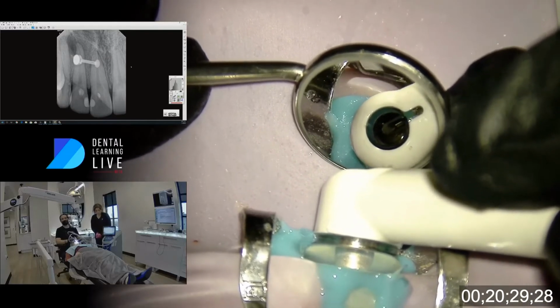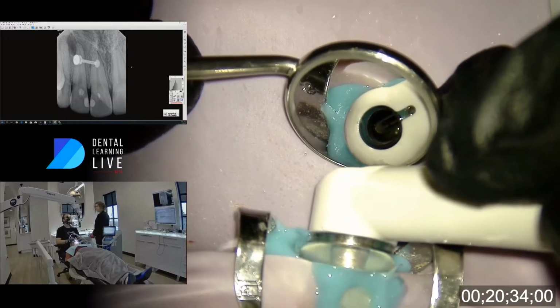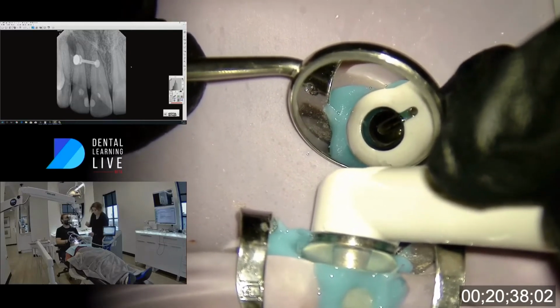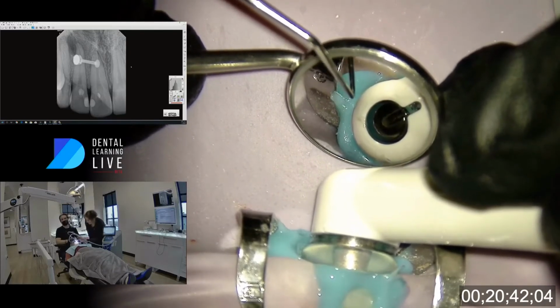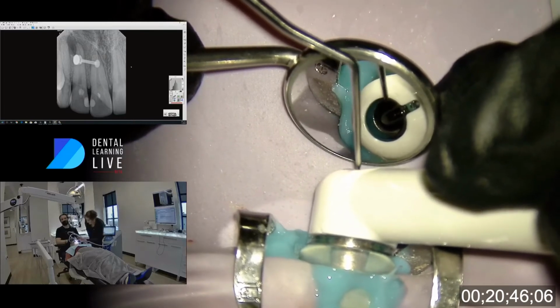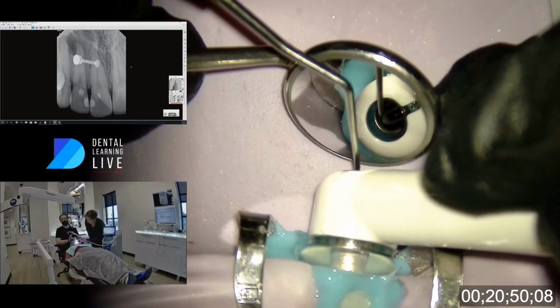Right at the tip of that, do you want to point with an Explorer, Lindsay, what I'm talking about on the mirror, if you can? The dancing bubble right there at the tip. Go up to the center in the window. There, a little bit. Yeah, that works. Okay. Right there. Yeah. So that little white dot is what I call the dancing bubble.